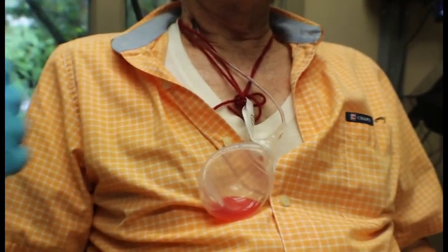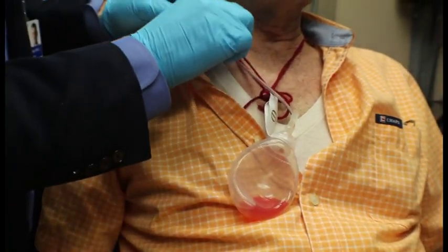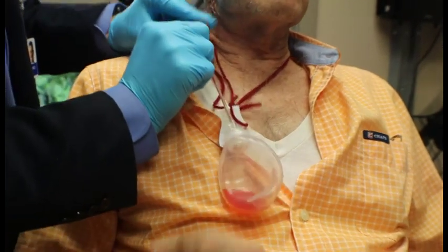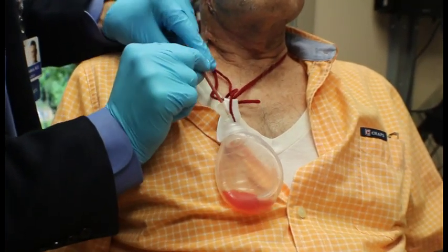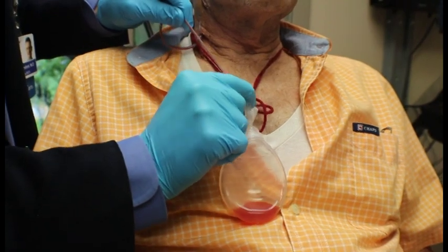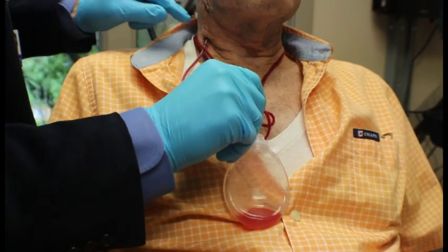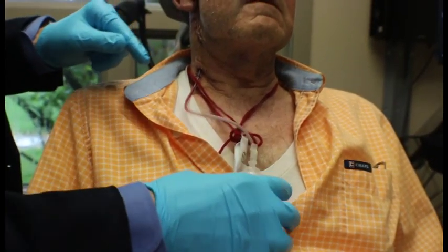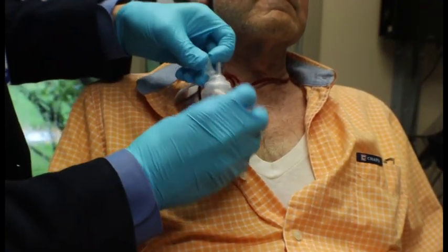I'll demonstrate stripping the drain. You hold onto the drain with one hand so you're not pulling directly on the skin, and then with the other hand you pinch the tubing and slide your fingers down to strip and milk the contents toward the bulb. Stripping the drain helps prevent clots from plugging the tubing.